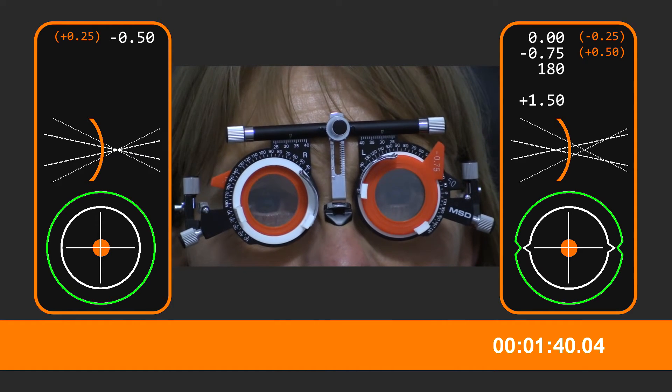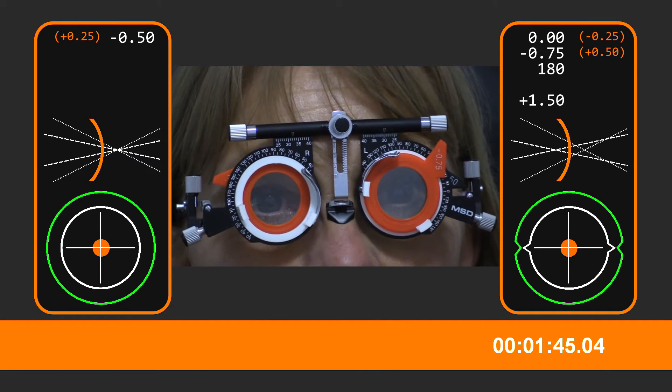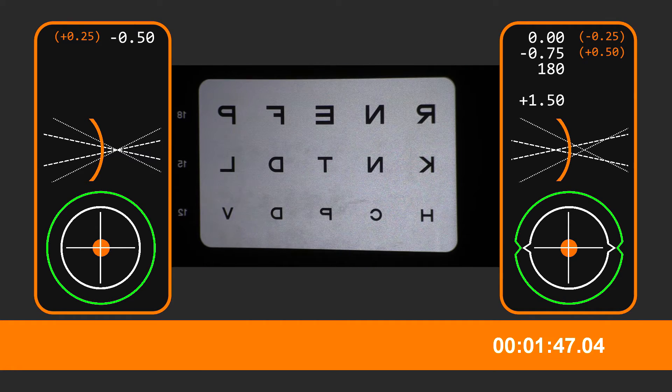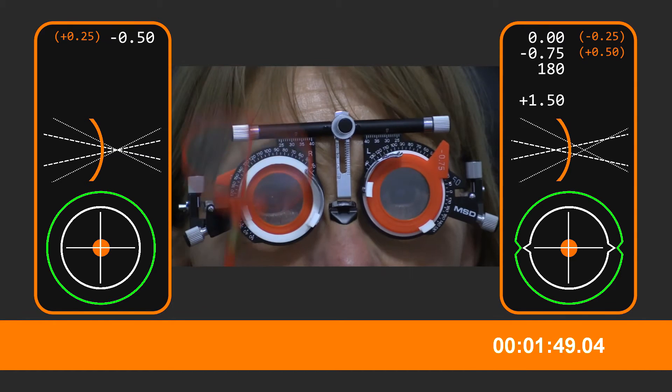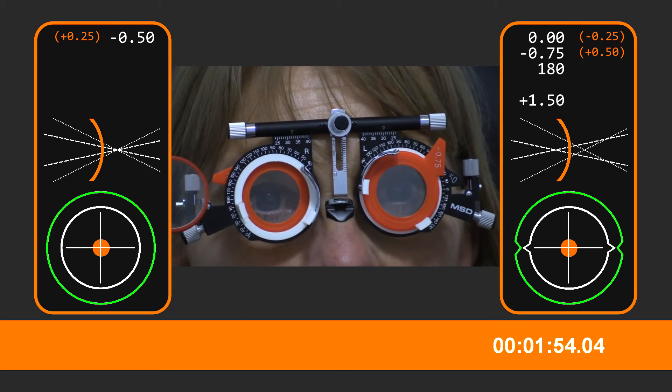Now, we're going to work on the right eye. I want you to keep both eyes open, okay? Can you see the bottom line there, the H, C, D line? If you look at those letters there, are they clearer with this one or clearer without? Without. What about this one? Without.